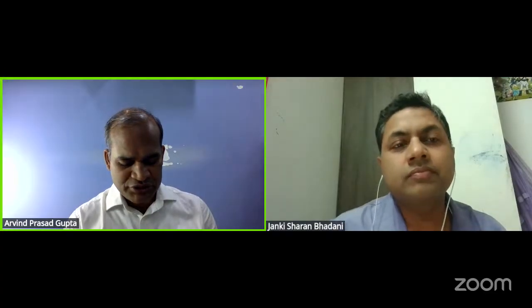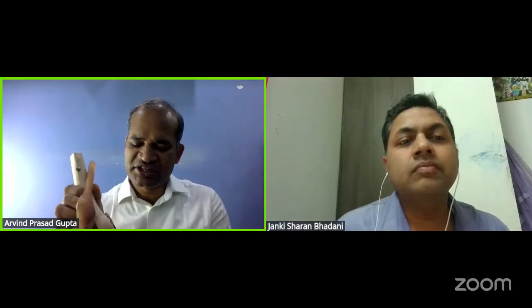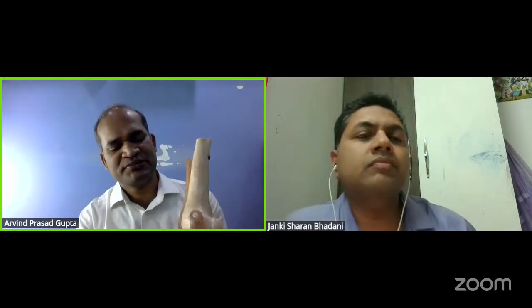Very good question. In multi-ligament reconstruction, you make all the drill holes for the ACL, PCL, and posterolateral corner. You first do the intra-articular part, the tunnel making, and then you pass the graft on the PCL femur, then the ACL femur. Then on the tibia, you first fix the PCL because the PCL is your central stabilizer. Once you fix this in position, your knee settles, becomes stable and reduces.